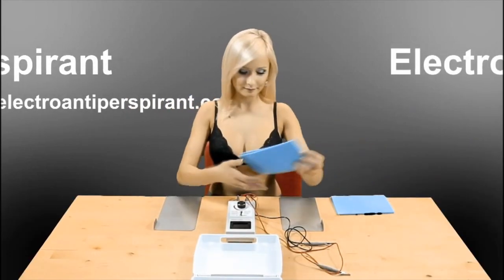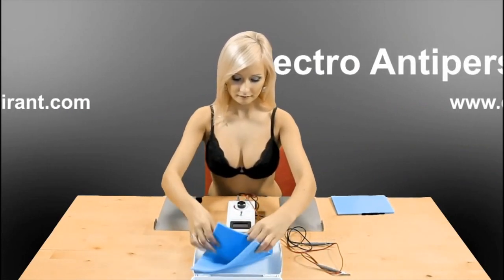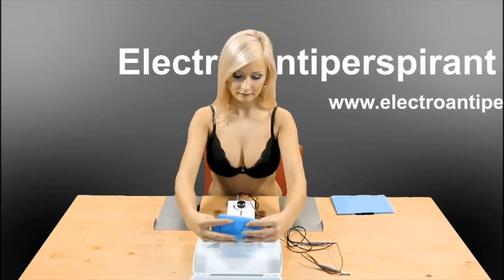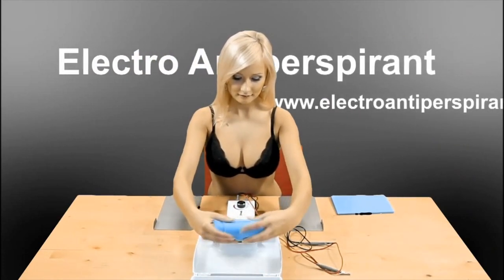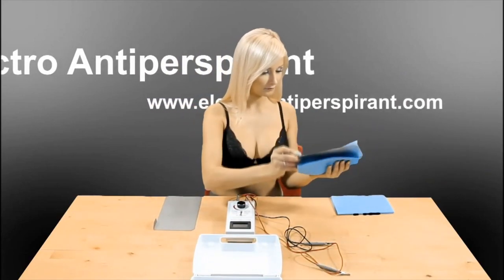Electro Antiperspirant can also prevent excessive armpit sweating, for which the included adapters of a very absorbent material are used. Dip them both in the water so that they absorb as much water as possible, place the electrodes in the adapters, wrap them thoroughly, and place them in the armpits with the handles pointing down and out.